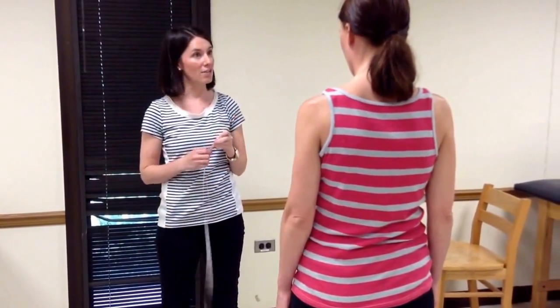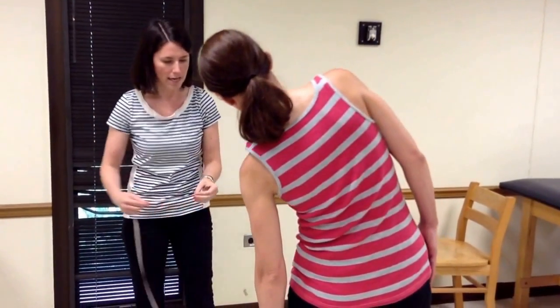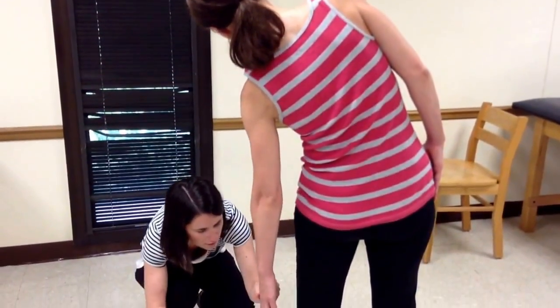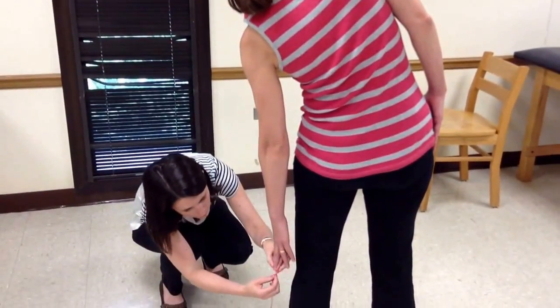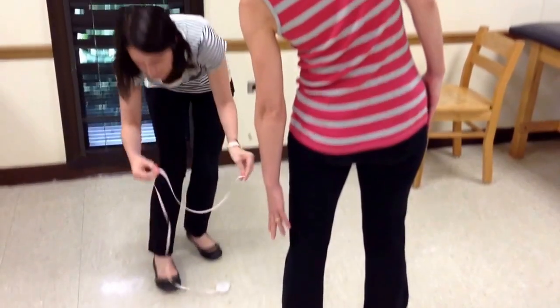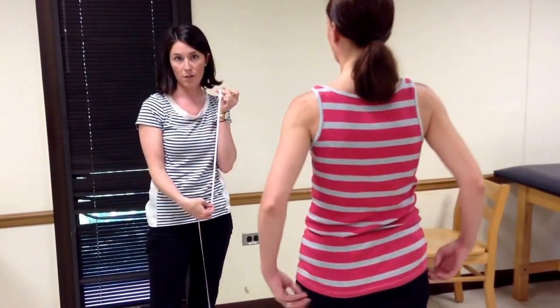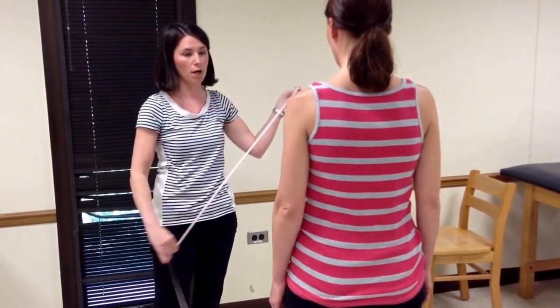So I'm going to have you do that motion again — bring your left hand down the side as far as you can go. Then relax your hand to the side. I'm measuring from the distal end of her long finger perpendicular to the floor. I use centimeters because that's more accurate, and I read how many centimeters it took her to go from her fingertip to the floor.